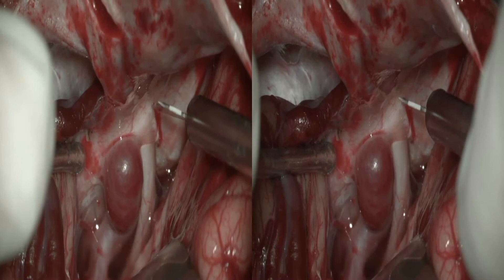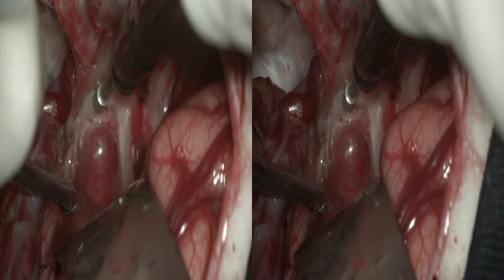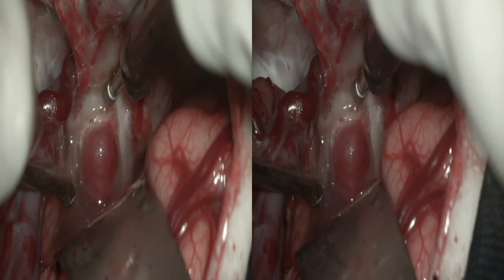The dura mater was cut medially from the optic canal to the clinoid process. Drilling was performed at the base of the clinoid process with a 3 mm diamond tip to expose the distal carotid dural ring. Working with caution due to the thinness of the aneurysmal wall, the swirling blood inside the aneurysmal sac can be seen in the surgical video.